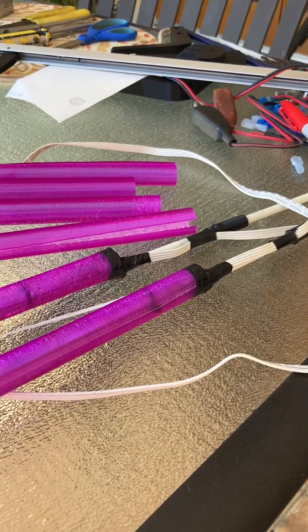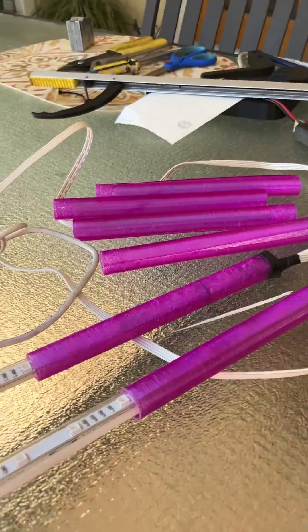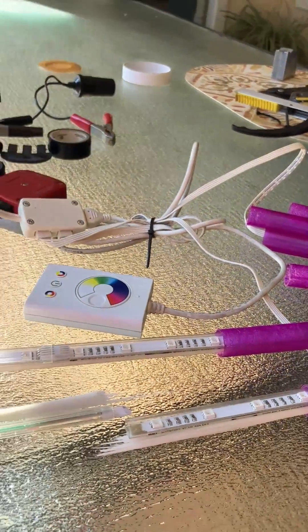The LEDs were so bright that I had to cover them up with translucent shades that I printed on my 3D printer.